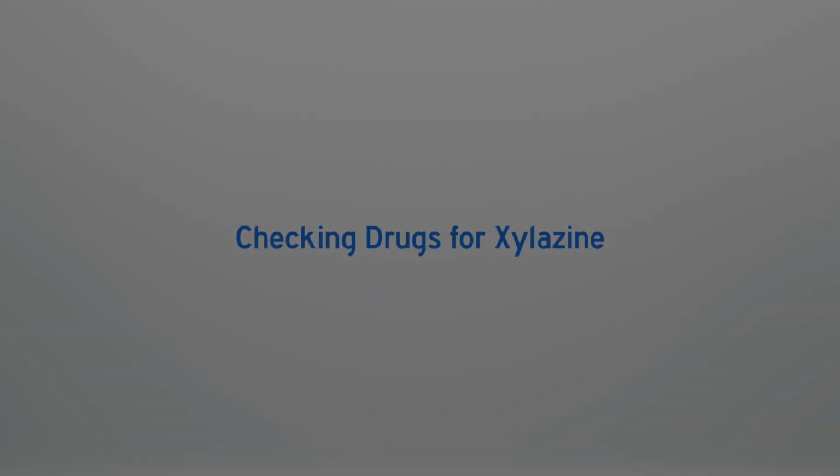This is a simple guide to check your drugs for xylazine. Why should you check for xylazine? This video resource walks you through the steps for checking your drugs for xylazine.